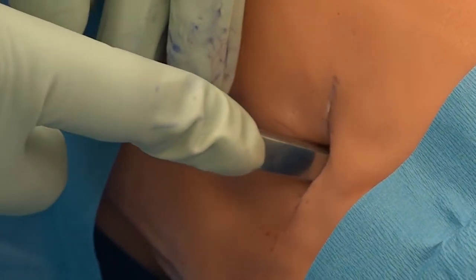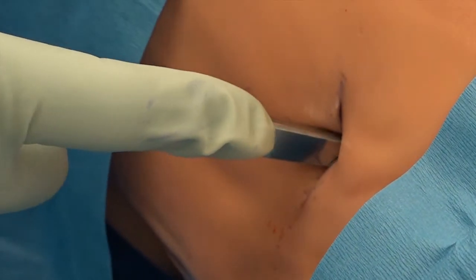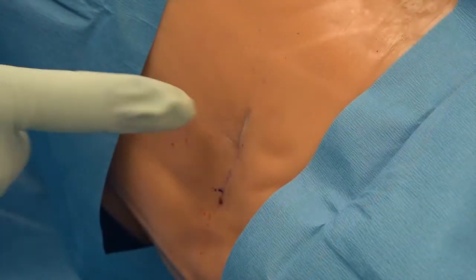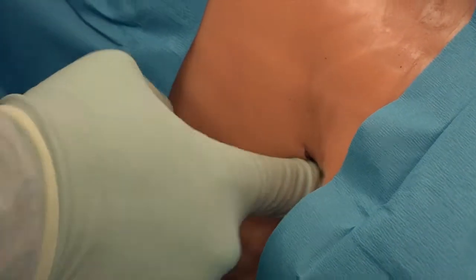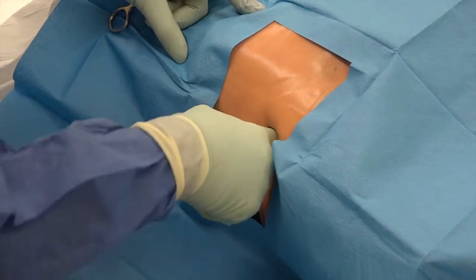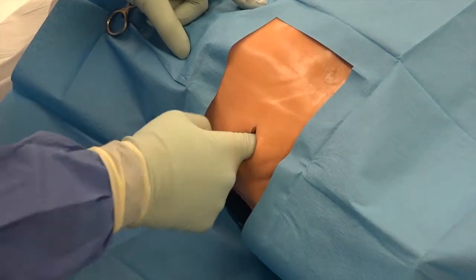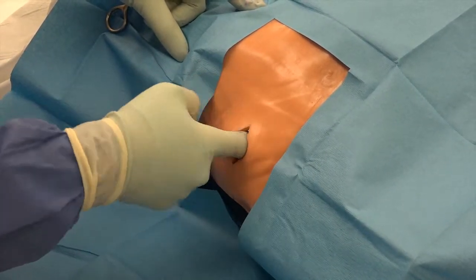Continue with blunt tissue spreading to dissect over the rib, through the intercostal muscles and into the pleural space. Use digital confirmation to ensure entry into the pleural space. You should be able to feel the parietal pleura and lung before continuing. Always remember, the first thing in the chest should be your finger.